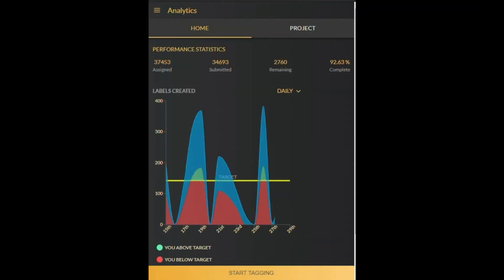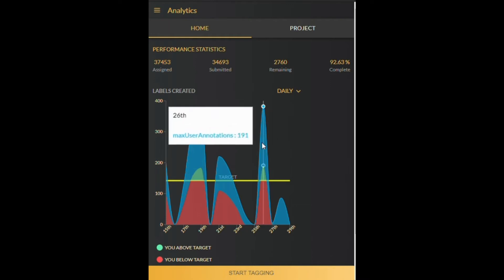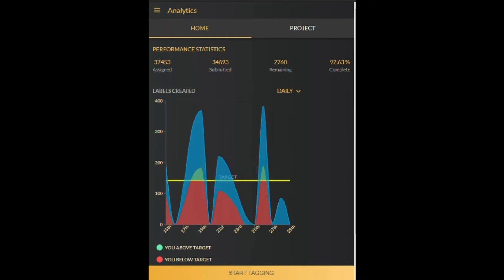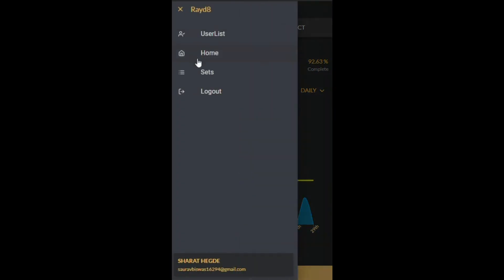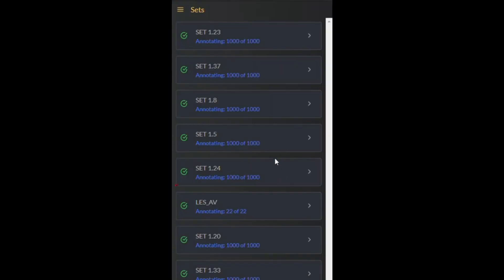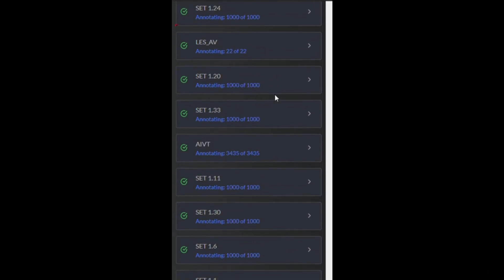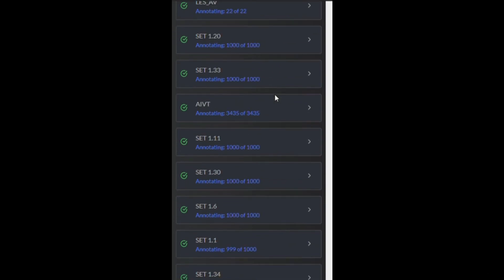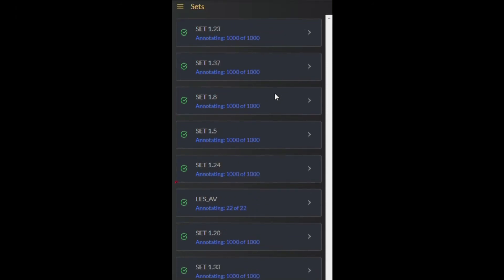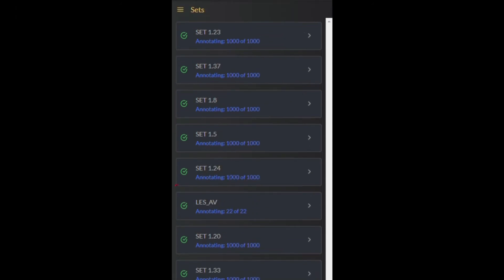The analytics on the landing page show the pending and completed images. The graph shows the maximum number of images annotated by other users in real time and gives a daily target setting. These imaging datasets are generally in the range of thousands, so we chunked them into sets each containing a thousand images or less, which a grader can complete within two weeks.